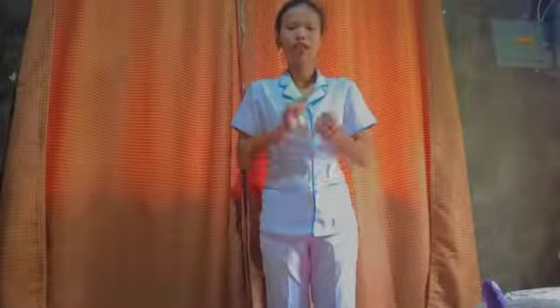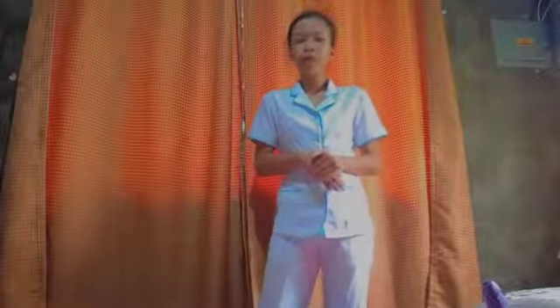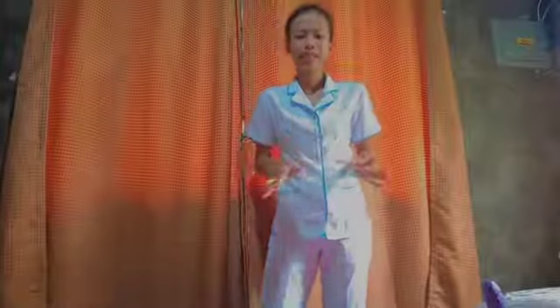Good day again. This is now our male catheterization. Catheterization is a process to drain urine from the bladder by placing a tube called a catheter. It is usually used when people have difficulty urinating naturally, to empty the bladder before or after surgery, or to help perform certain diagnostic tests.